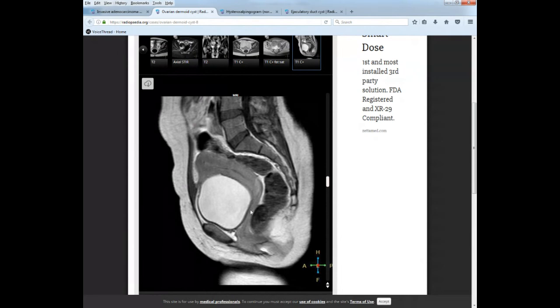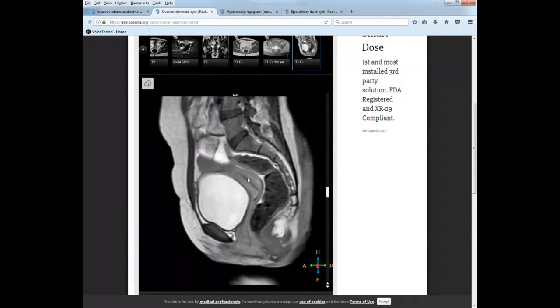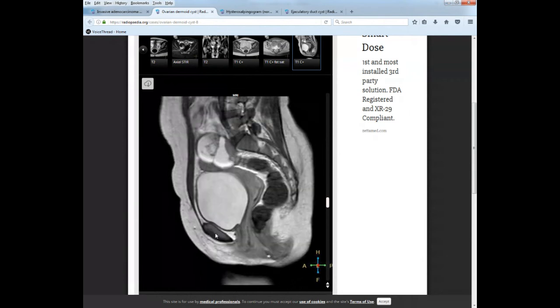So here's your uterus, anteverted, the fundus. You can see the uterine cavity in here, this little opening here. It's going to curve around. This area here is your cervix, the two separate openings, and then into the uterus. Here's vagina, sandwiched between the bladder and the rectum. This is pubis, symphysis pubis here.